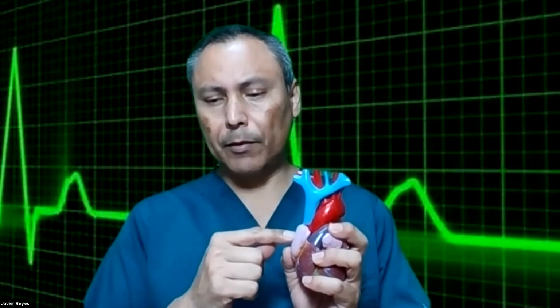There you go. So, got it? The SA node to the AV node. This is the first degree. So, write it down, commit it to memory. Any delay in the impulse from the P wave or SA node to your AV node, which is your PR interval, is affected, you have a first degree AV block.